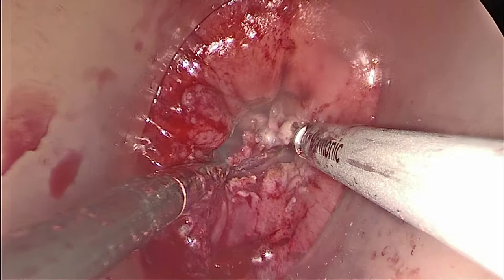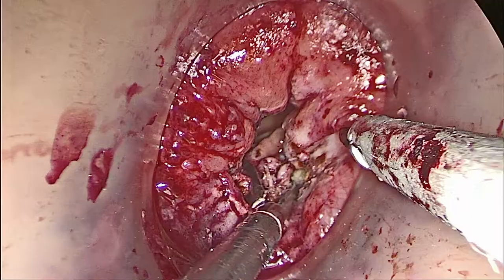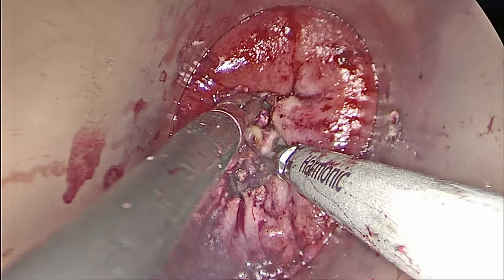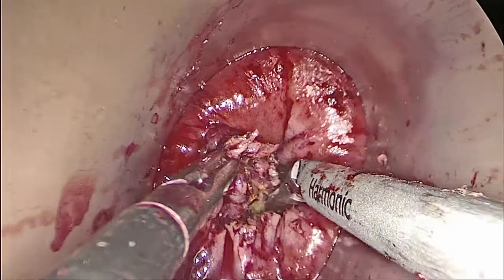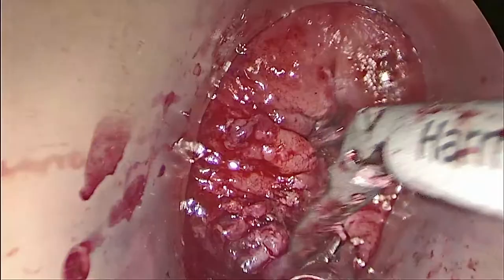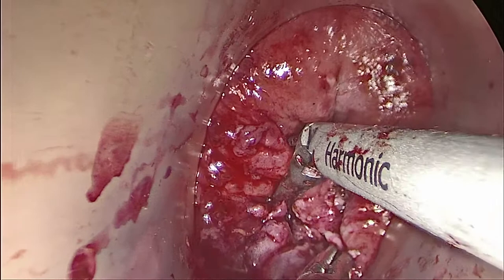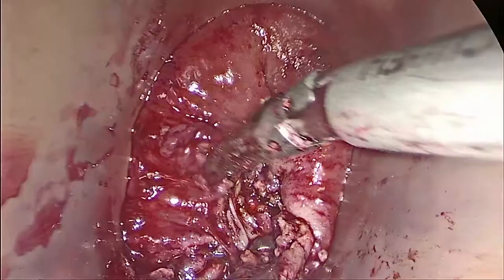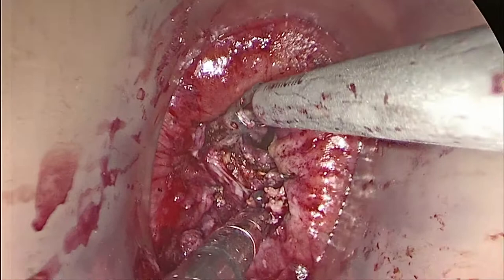One of the biggest difficulties in this patient was the exposure of the tumor, which was very low. To improve it, it was required to reduce air loss by having the assistant hold the port. One of the most important things is to try to remain perpendicular to the rectal wall in order not to compromise the deep margin.